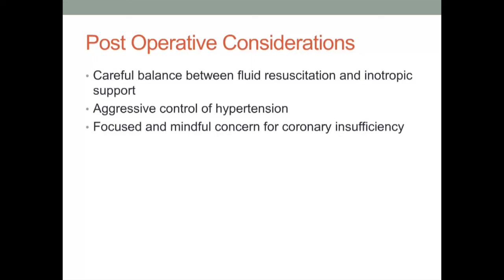Especially in cases of coronary reimplantation, any anatomic distortion may be exacerbated by an enlarged heart during the postoperative period. Prosthetic valve replacement can also impact ostial anatomy and prove to be responsible for obstruction regarding coronary perfusion. In cases of full root replacement, the option of coronary arterial bypass grafting in cases of coronary insufficiency may be entertained.